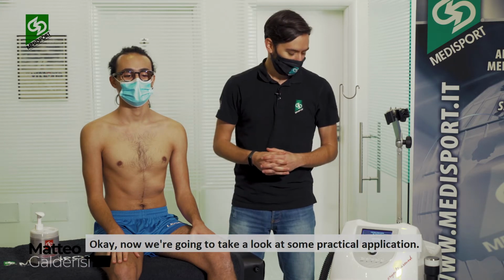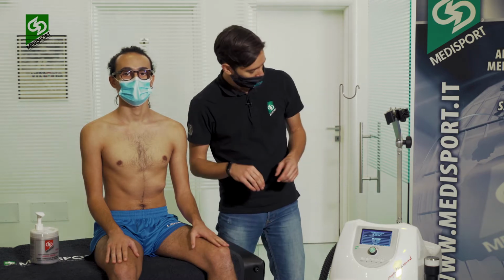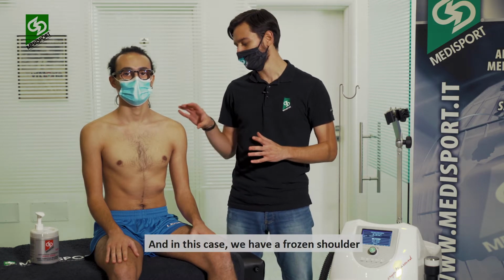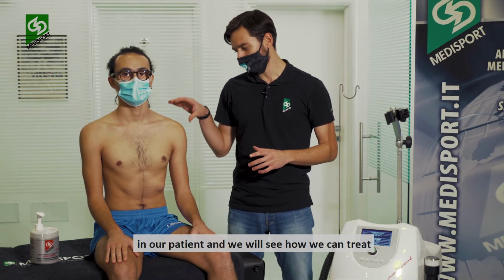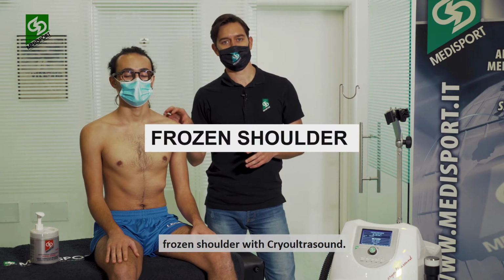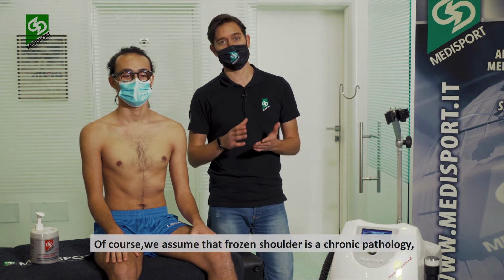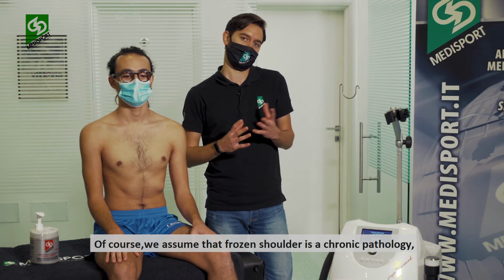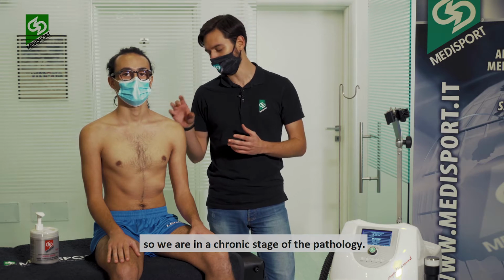Okay, now we're going to take a look at some practical application. We're going to start with the shoulder complex. And in this case, we have a frozen shoulder in our patient, and we will see how we can treat frozen shoulder with cryoultrasound. Of course, we assume that frozen shoulder is a chronic pathology, so we are in a chronic stage of the pathology.